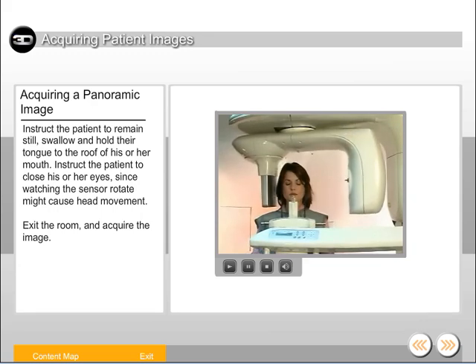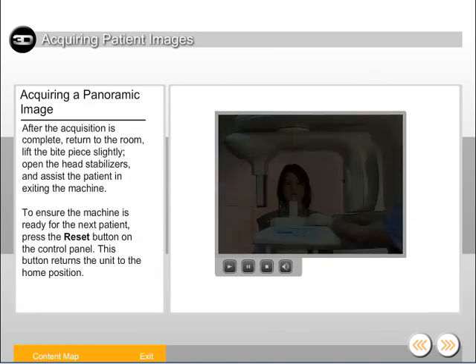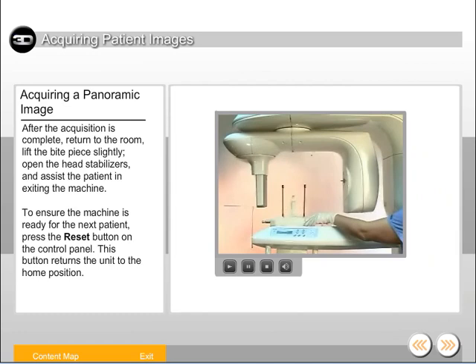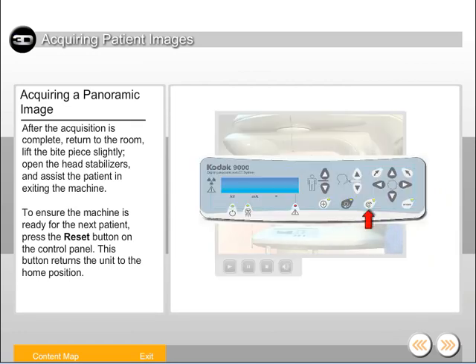Exit the room and acquire the image. After the acquisition is complete, return to the room, lift the bite piece slightly, open the head stabilizers, and assist the patient in exiting the machine. To ensure the machine is ready for the next patient, press the reset button on the control panel. This button returns the unit to the home position.